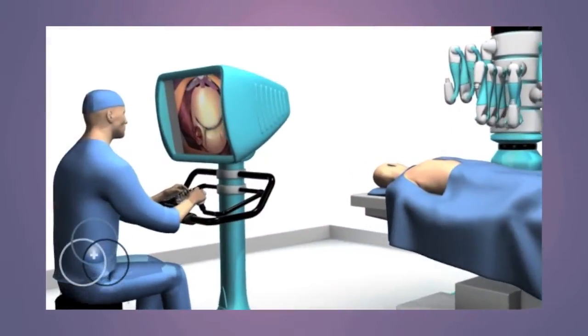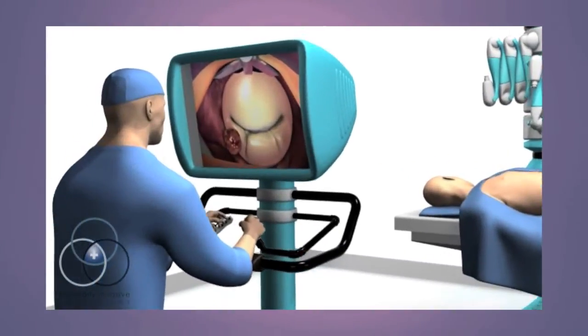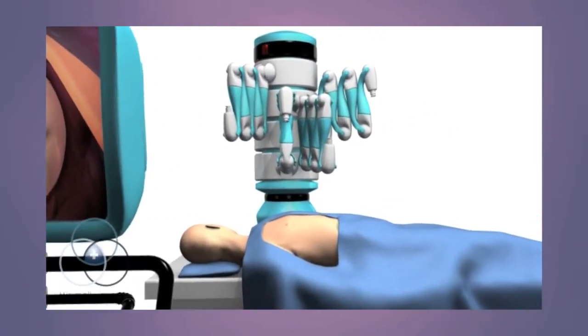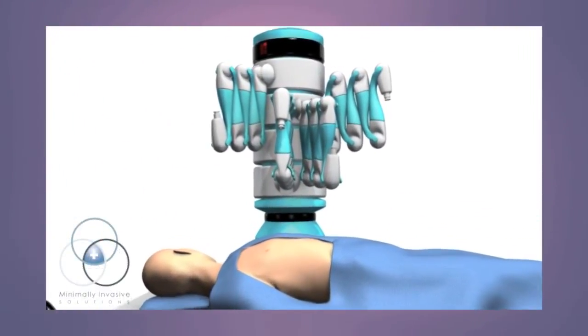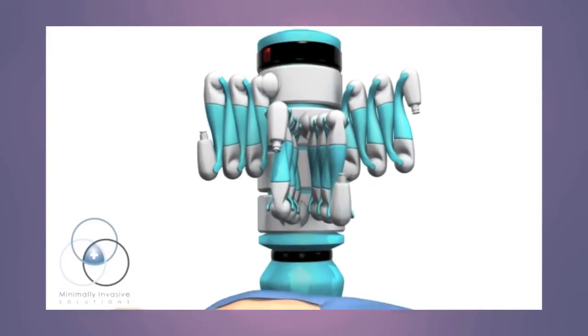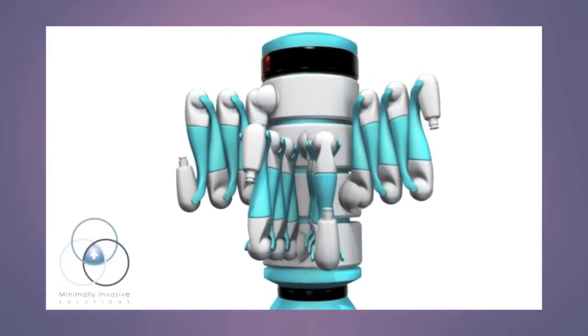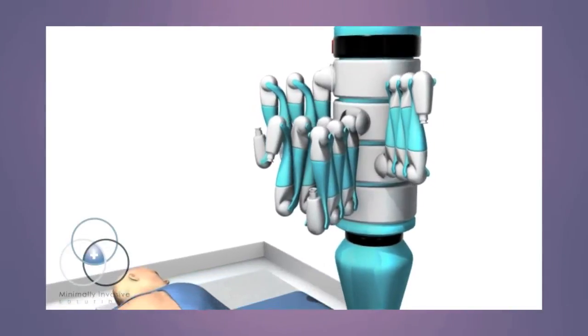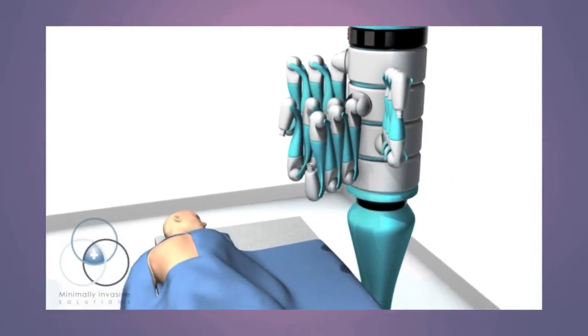The robotic myxomal excision involves the removal of a tumor in the heart. The robot enables the surgeon to perform the operation through much smaller incisions. The robot has four arms — three hold instruments and one holds a camera — providing a magnified three-dimensional view inside the heart.